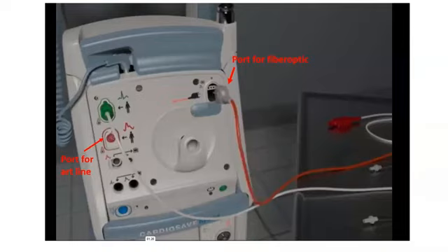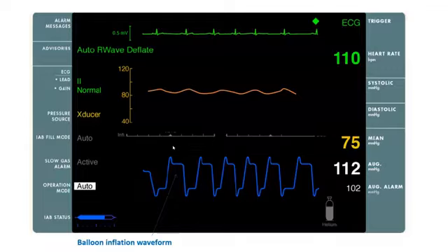There is another troubleshooting idea that I alluded to earlier. So you have a case like this one where the gas waveform is appropriate and properly timed to the EKG, but the arterial waveform is flat or distorted or totally erratic or totally absent. The issue in this case is dysfunction of your arterial monitoring line.